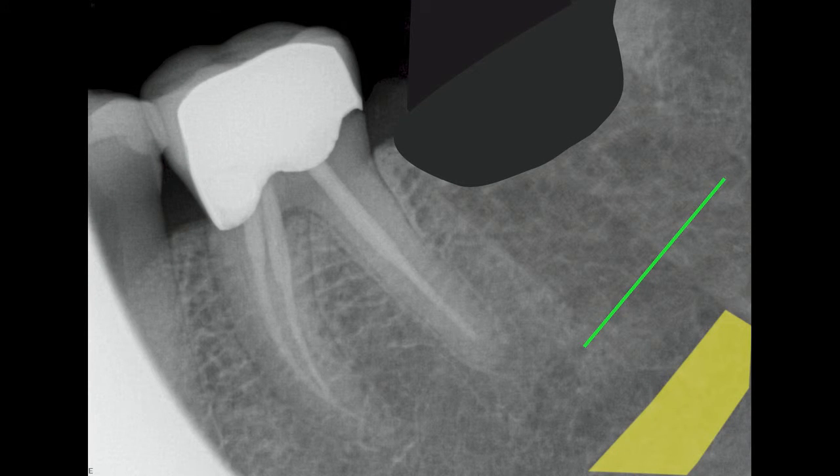In this image, I'm showing where the nerve canal is. When placing an implant, you have to stay two to three millimeters away from this canal. Without a bone graft, that would severely limit our options for placing an implant in the future.